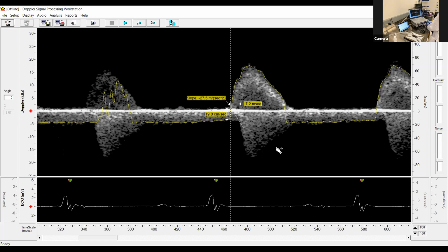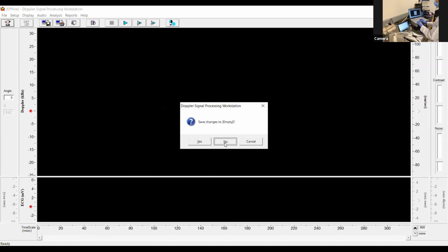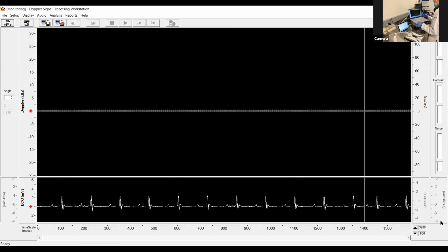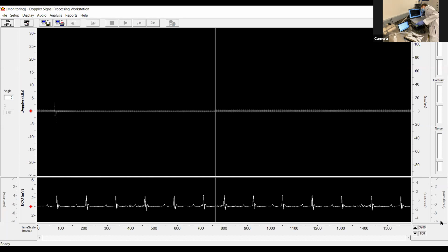Did you want to try the mitral one last time? We got about 10 minutes. Okay, perfect. Right, okay. So Sydney's going to unswitch the cords at the back.